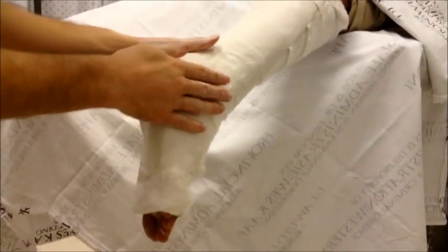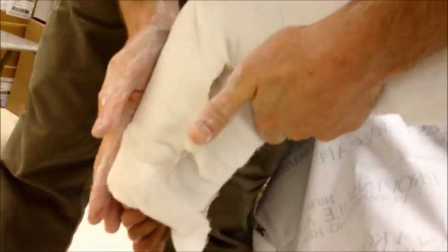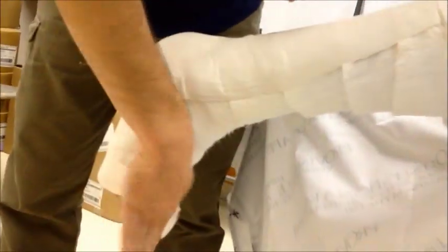It's somewhere at this point now where you would be molding or manipulating your fracture if you needed to. Keeping in mind that you want to try and get as close to neutral as you can and that you don't want any tilting of that plane.